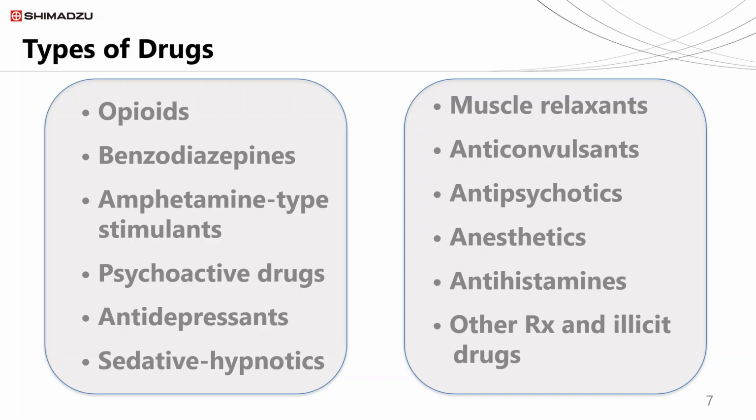These are the different categories of drugs which are normally monitored. Opioids, antidepressants, sedatives, and other prescribed and illicit drugs are the typical targets for toxicological analysis.